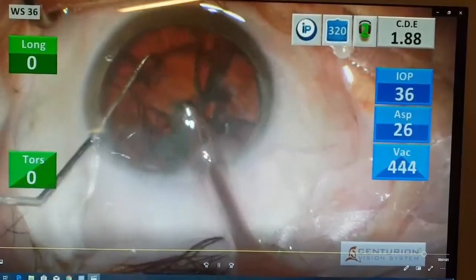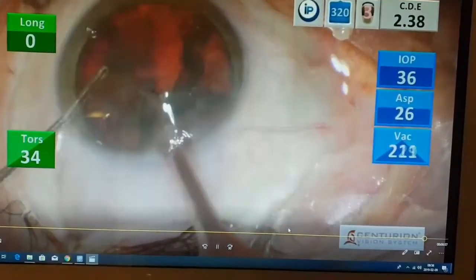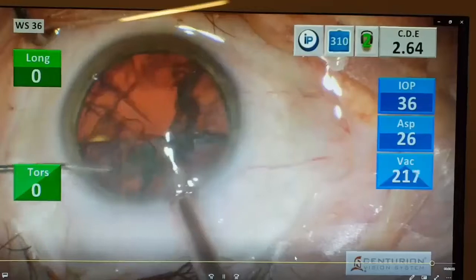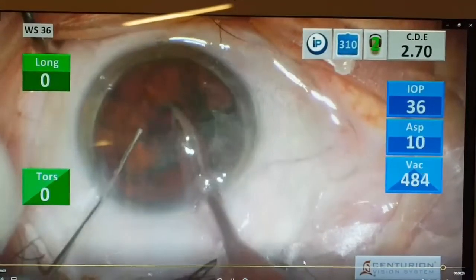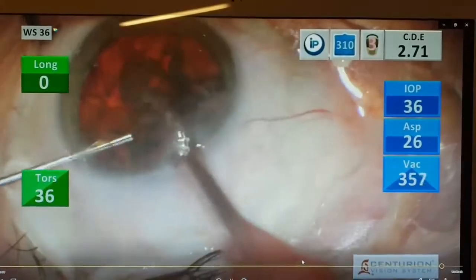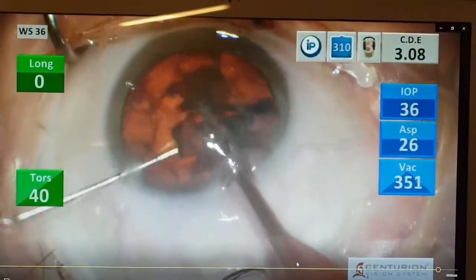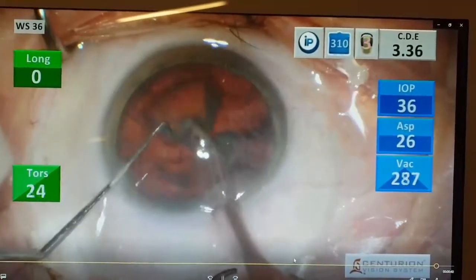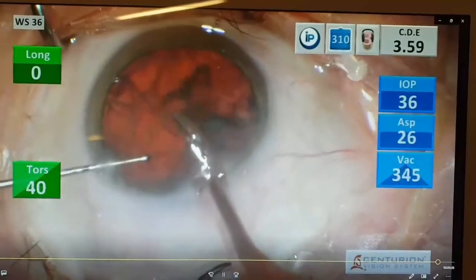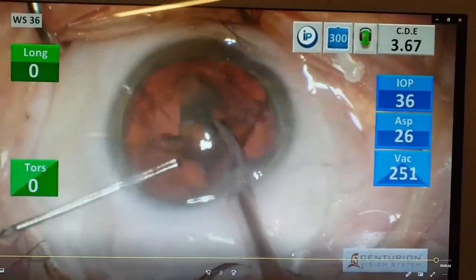As we notice here in this surgery, the Phaco tip is almost stable within the safety zone. On the supracapsular level, most maneuvers are done with the chopper, which has a sharp edge, and this will reduce the instrument tissue resistance. That's why we get a good cracking effect and very sharp edges of the fragments.